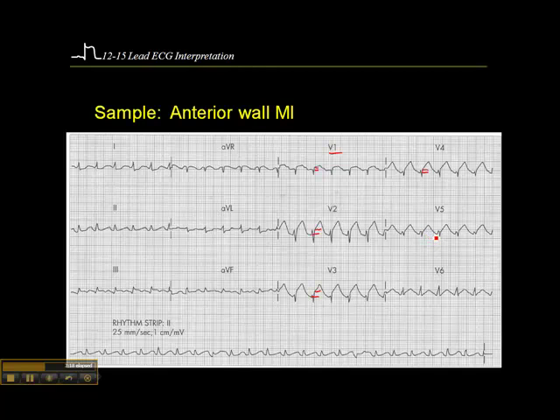V5 is a little more difficult to say, not entirely sure. But V6 — there's clearly no ST elevation, so we can rule out a lateral wall infarct. So this is a patient with an anterior septal wall infarct.